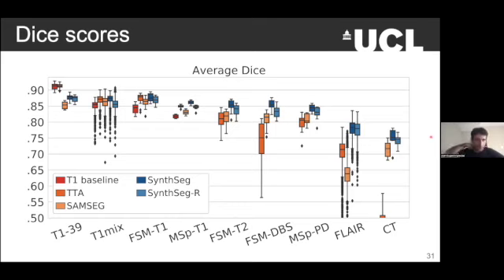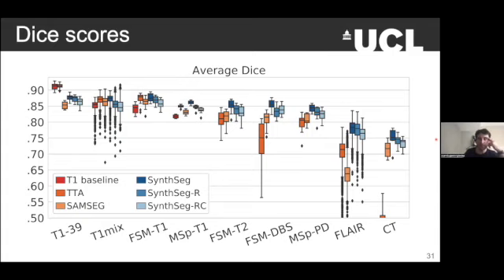And this is the interesting thing, or one of the interesting things, is what happens when you use the resolution specific network. So here we are training for the CT and the FLAIR. We are training with 3 and 5 millimeters respectively. It actually gets a bit worse, which you may or may not find surprising. Same thing with the specific resolution and contrast. So, I mean, this is consistent with converging evidence that with these neural networks that are so good at interpolating, but not so great at extrapolating, it is really helpful to simulate data that goes well beyond what's realistic.